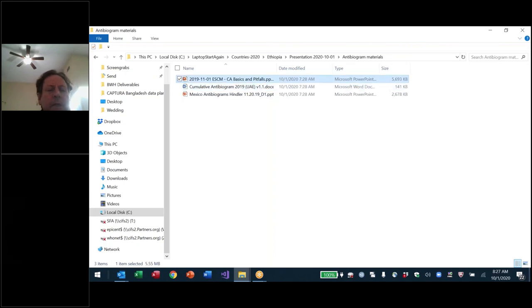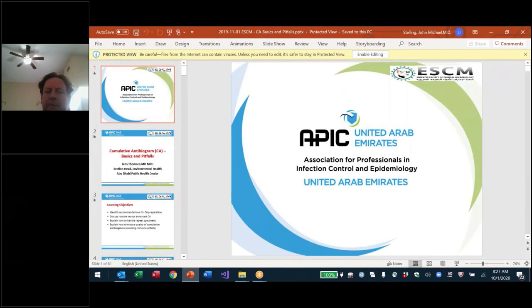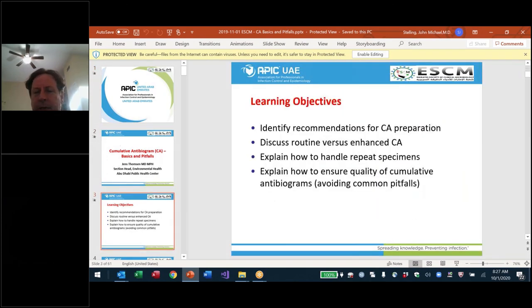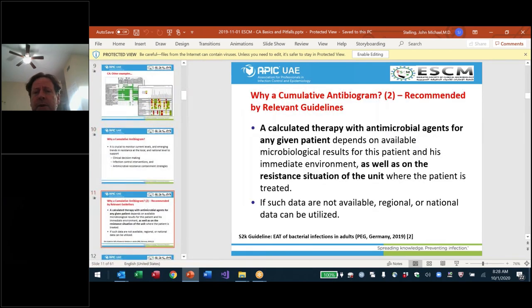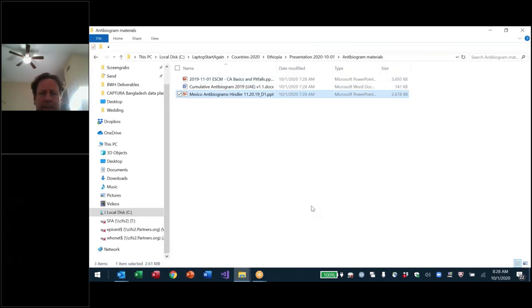A second document is two presentations. So the first one is this PowerPoint, and I think this one is from the United Arab Emirates. Cumulative antibiograms: good things, bad things, basics, caveats, biases. It's 61 slides. So you see here, he's got the colors. If you want to go through this on your own, you might learn some useful things, or you might want to develop some of your own training materials. Why do you do these? Inform clinicians, guide, inform. So it's not one thing. There are multiple objectives for different audiences. That's a presentation he gives.